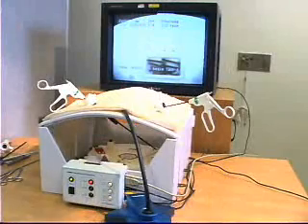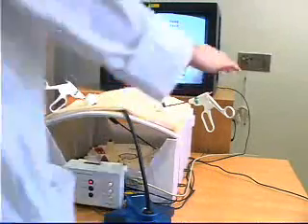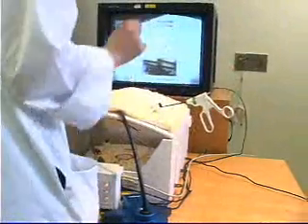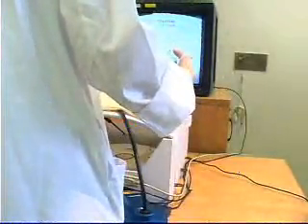The LTS simulator includes 10 tasks scored for speed and precision based on preset cutoff times and maximum penalties. A brief overview of the tasks is presented here, and each will be explained in more detail as we go along.